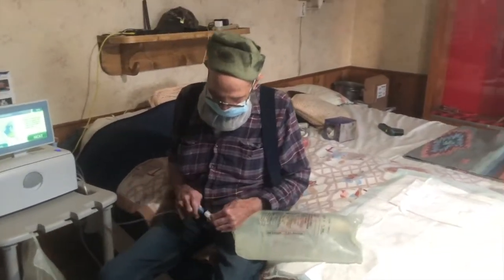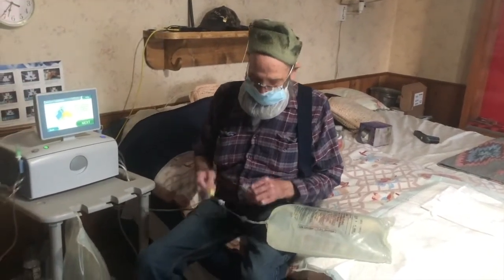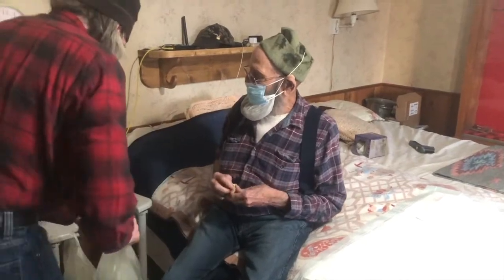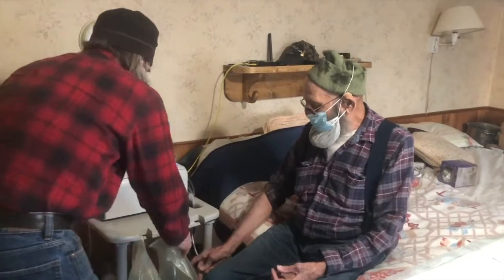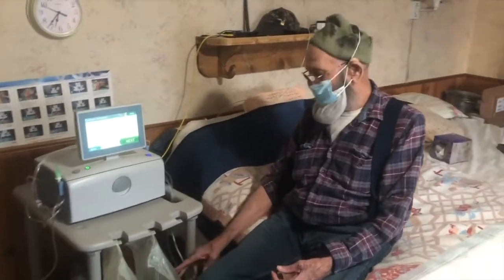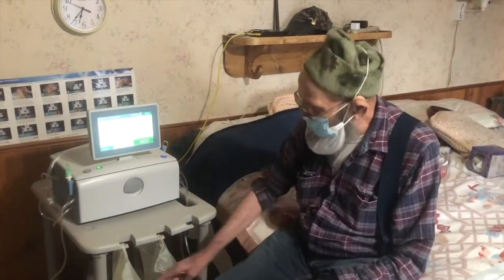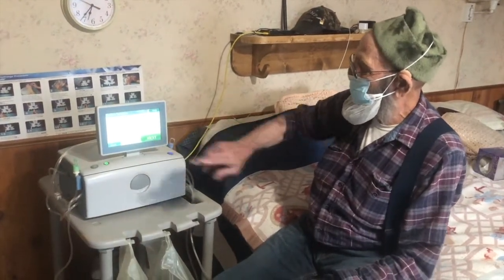And here we go again. Once you get that done, confirm connected solution types and concentration values. You want to make sure that you got the right solution. You always check that a second time, that it's the 1.5 and it's the 6,000, and that's what it is. So you agree with that and go on to the next one.